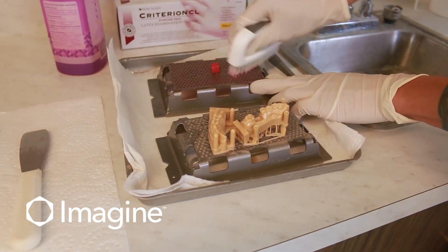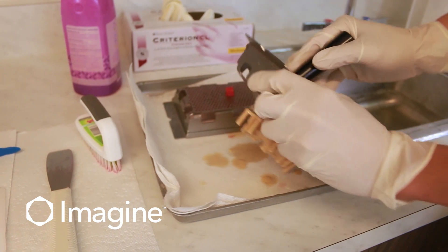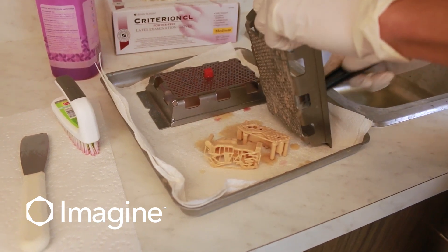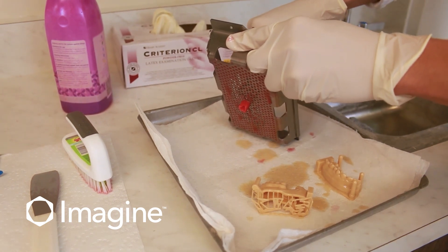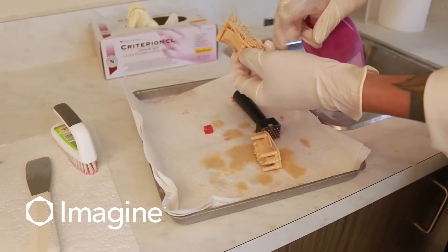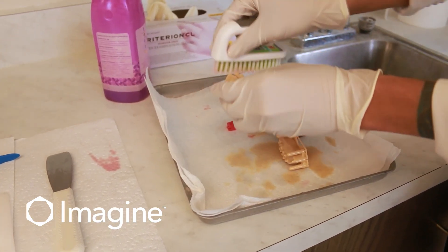From there, we're going to use the material push to gently push the materials off of the build platform. If you need to, you can also use the metal spatula. We're just going to gently push, and we'll place our build platform to the side to be cleaned later. Once the units are removed from the build platform, brush any excess material off with isopropyl alcohol and a soft brush, then place them into the initial dirty bath.